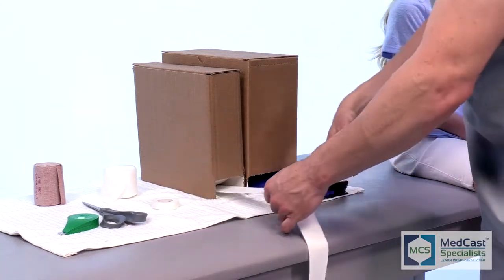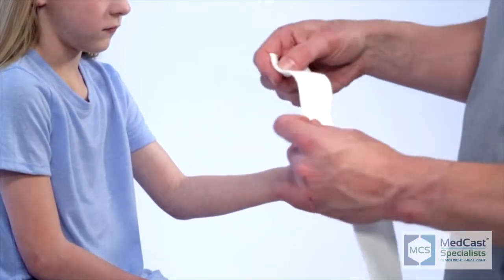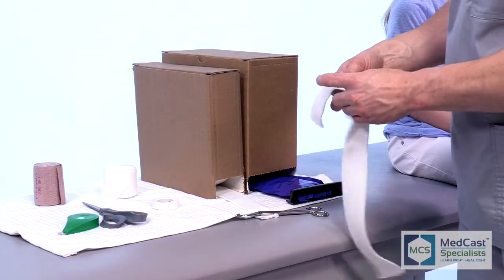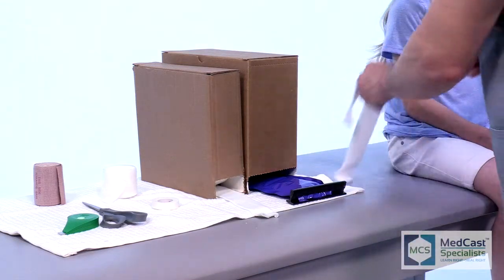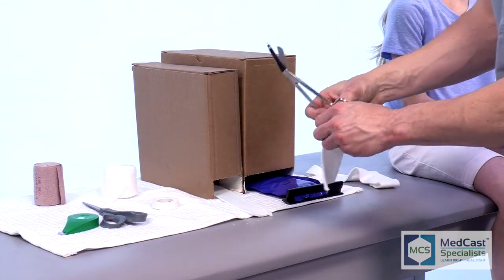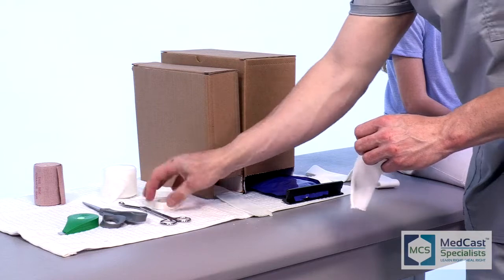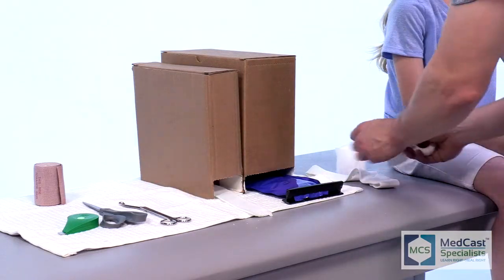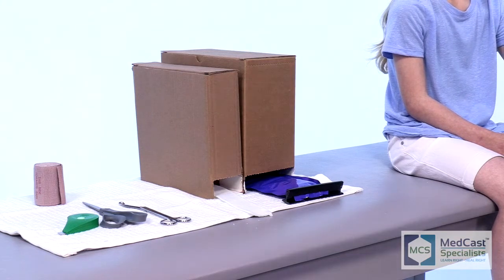We're going to do this customized — we're going to use the stockinette and cast padding, make it look really nice, and it's going to function perfectly. Sometimes this splint will be used for the entire duration of a forearm fracture and the patient will never actually be placed in a hard cast. We'll use the splint and customize it for up to four to six weeks for a forearm fracture.